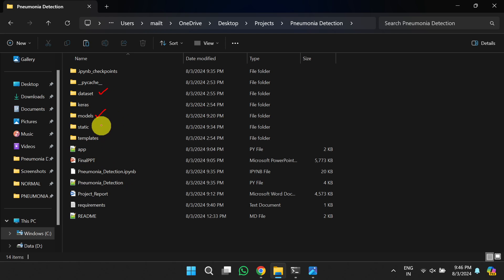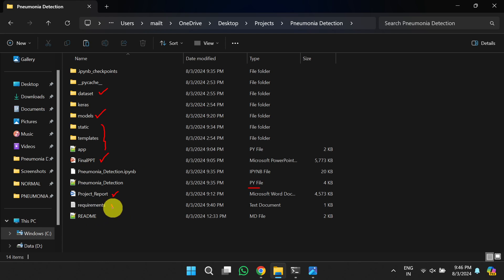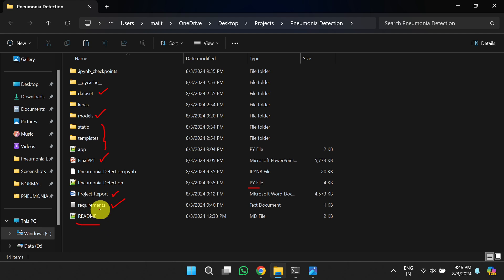The static folder and app are related to the frontend, which is designed using the Flask library. You will also get the PowerPoint presentation as well as the complete report. The source code is present in both versions: IPython notebook as well as a .py file. The requirements file contains all the required libraries to execute this project, and the very important README file contains instructions to set up and execute the project.